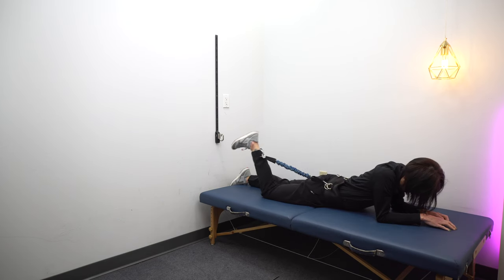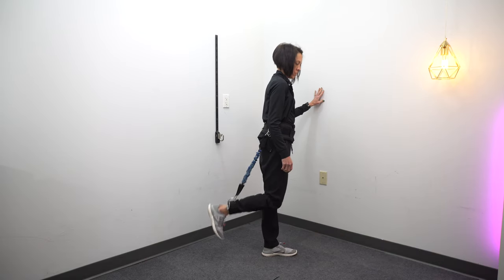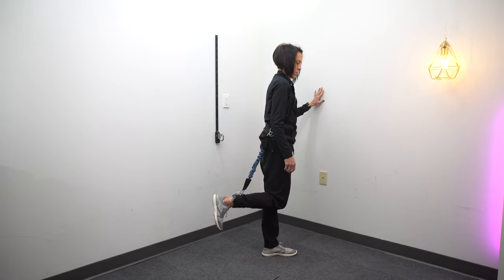You want to work on hip extension with knee flexion, but for a lot of you that's near impossible. The best way to do that is to start with an active-assisted method — and that's again where this belt comes in so handy. Starting on your back with hip extension and knee flexion, then progressing to standing, then progressing to walking.